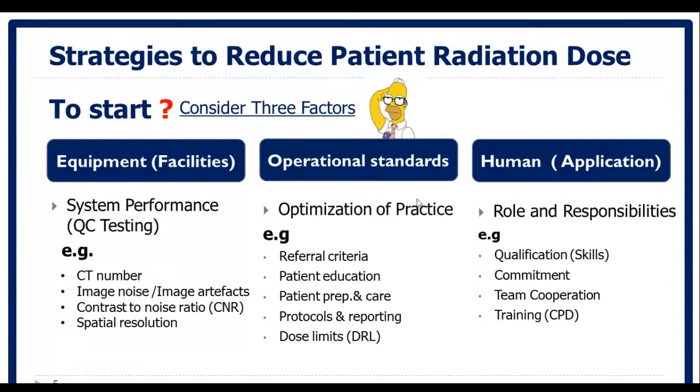For optimizing the practice, we need to have certain criteria related to referral, clinical referral, how to educate our patients, what about patient preparation and care, what about the protocols themselves, are there any guidelines for specifying the image quality, is there any benchmark related to this area, and how is the reporting by the radiologist, as well as the dose limits.